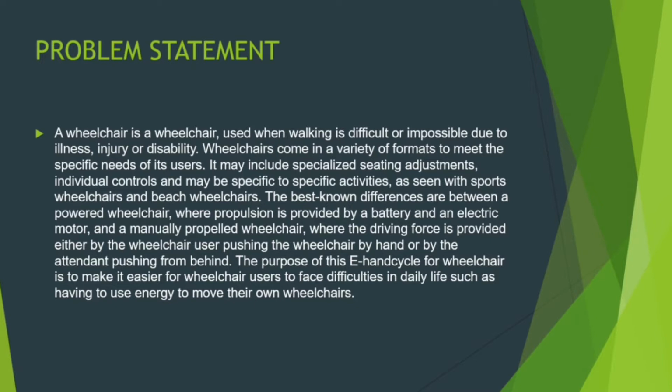The purpose of this E-Handcycle for wheelchair is to make it easier for wheelchair users who face difficulties in daily life, such as having to use energy to move their own wheelchair.